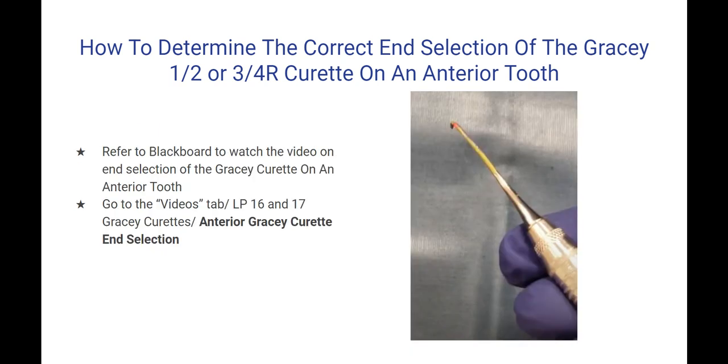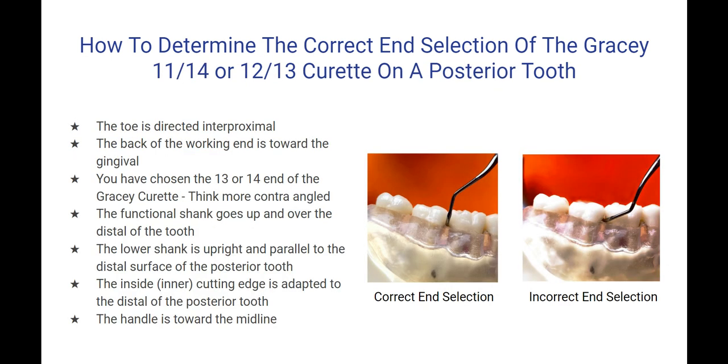Refer to Blackboard to watch the video on end selection of the Gracey curette on an anterior tooth. Go to the Videos tab, Learning Plans 16 and 17, Gracey curette, anterior Gracey curette end selection. How to determine the correct end selection of a posterior.